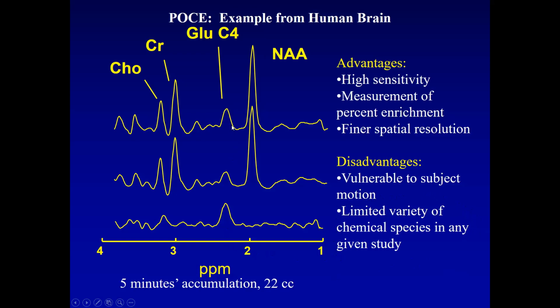The glutamate and glutamine are both present here, but because we're applying a radio frequency pulse in the carbon-13 domain and we are decoupling in the carbon-13 domain, our bandwidth to apply it safely in vivo is limited. So in the end, we were only able to look at the protons connected to glutamate carbon-4. So this approach is ideal for cases in which you want more highly specific regional information, but it is acceptable not to measure as many metabolites as you would otherwise want to.